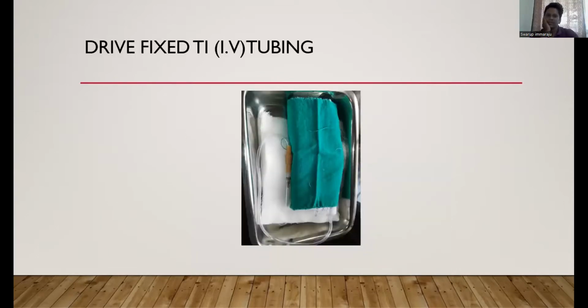Okay, so the drive is fixed to the IV tubing. You can see the green colored cloth covering the infusion pump, and the IV set connected over the syringe, and on the other end there is a needle placed in. This end is going to be inserted directly into the IV cannula site. You just have to open the IV cannula site, fix it there and leave it open, so the drug can be continuously entered into that. We'll talk about that. Don't get confused. I just wanted to show you the pictures and then go back to the scenario. Next slide, please.